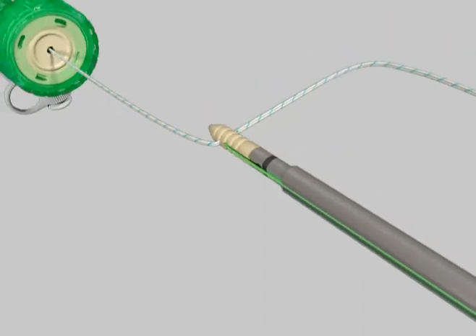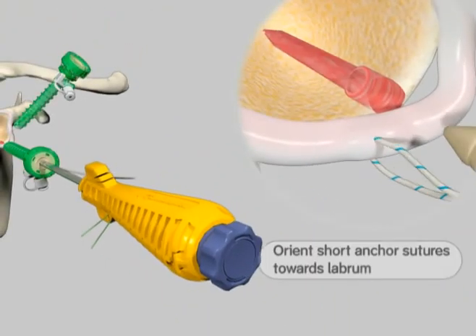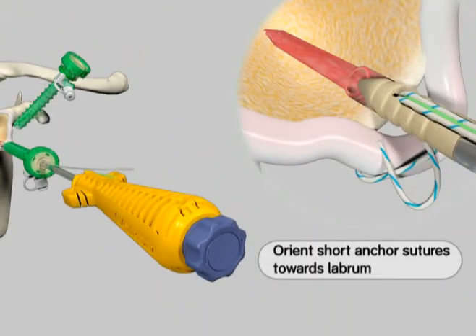Advance the loaded suture anchor into the operative cannula and toward the prepared hole. Orient the anchor such that the free limb sutures entering the anchor are facing the tissue. Do not tension the suture at this time.